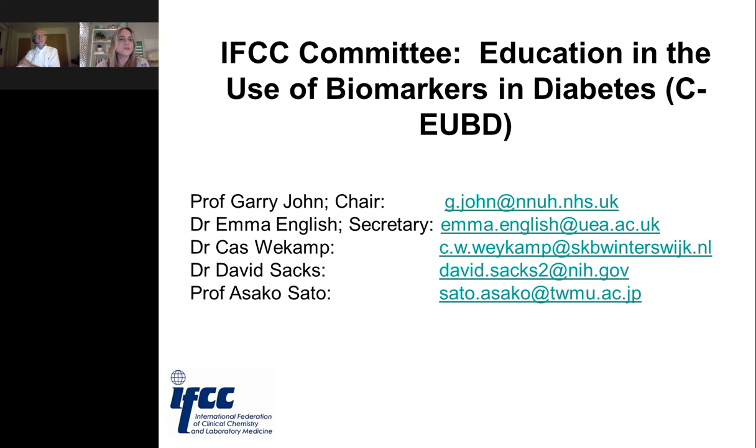Our next question. Of the 3 detection methods discussed for separation of hemoglobin A1c, charge, structure, or chemical differences, is there a preferred detection method to detect hemoglobin A1c?